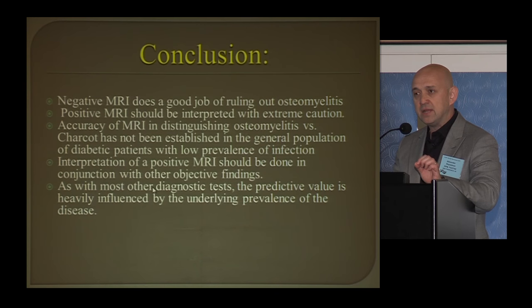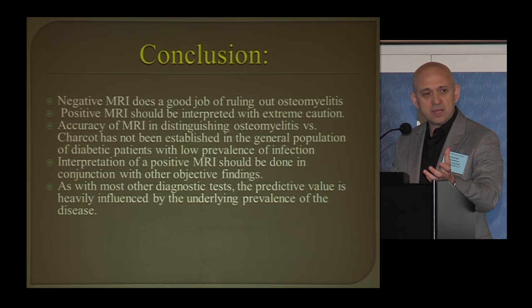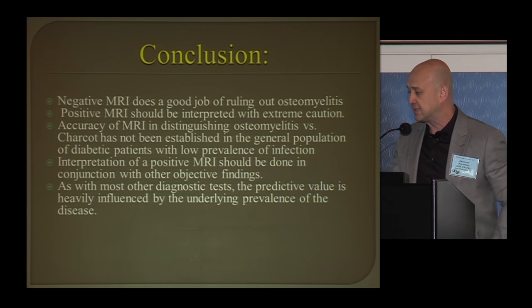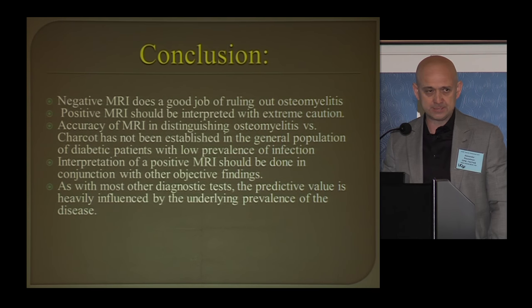That's why it's critical that a clinician who treats the foot actually evaluates the MRI, and not necessarily the radiologist, because the radiologists don't have the luxury of seeing the patient ahead of time and knowing what we know when we perform our clinical exam. And as with most other diagnostic tests, the predictive value is heavily influenced by the underlying prevalence of the disease.